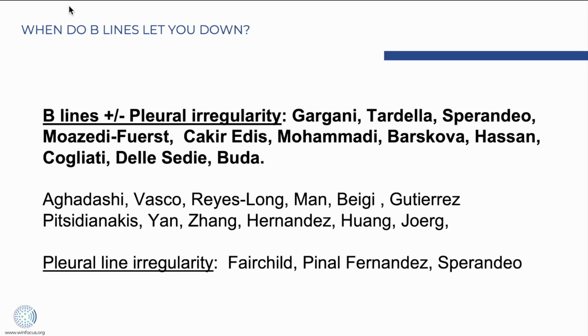To try to help us understand what are the typical findings that can be found in ILDs under lung ultrasound, many of our fellow colleagues have researched the role of B-lines and pleural abnormalities under ultrasound imaging for many years. But this is a field of rare diseases, so many of the studies have small sample sizes, with the largest being around 200 to 300 or so patients. And most of this research is reported in terms of correlations and followed by sensitivity and specificity, which of course are very dependent on pretest probability.